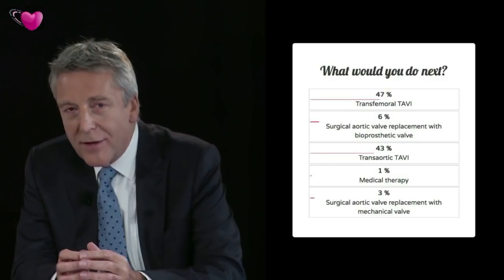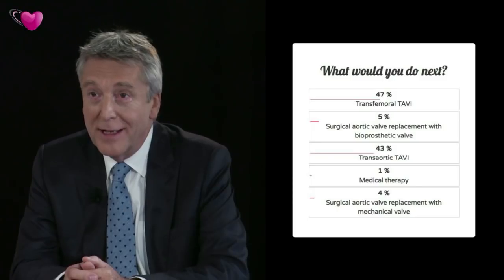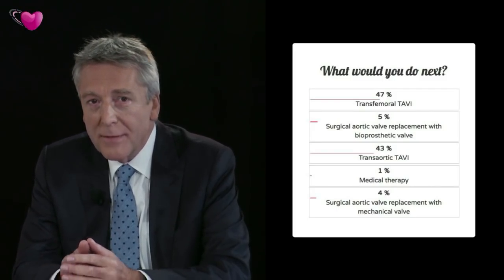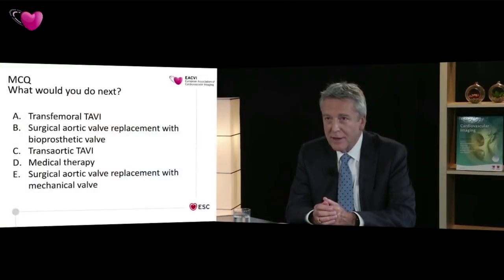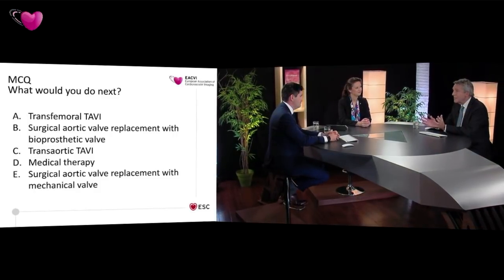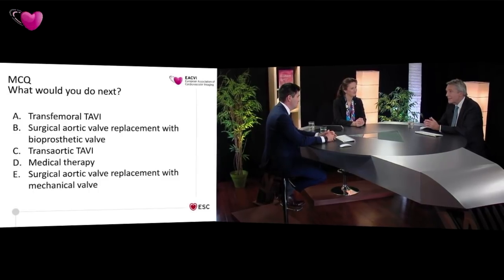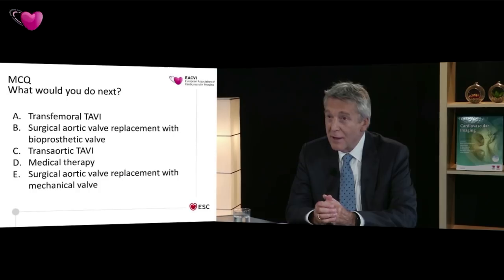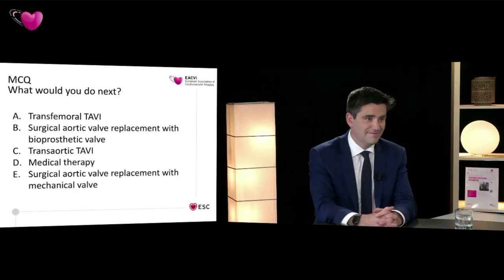Well, out of those 2, which I think is what it really does come down to, because surgery is clearly discounted in this patient, transfemoral TAVI could be done under conscious sedation, and with her impaired lung function, I think everyone would want to avoid a general anaesthetic. Now, I agree that peripheral vessels are a bit borderline, but I suspect that most interventional cardiologists would want to give it a go at least and see whether they can attempt it that way before thinking again.